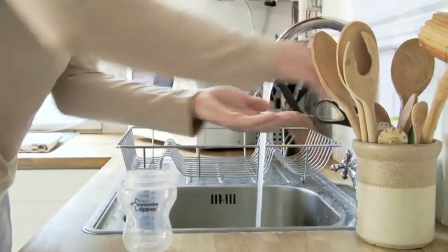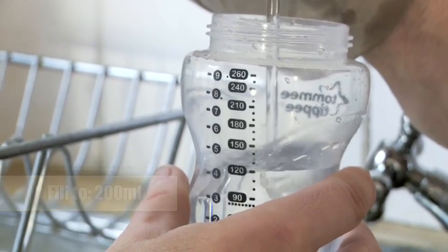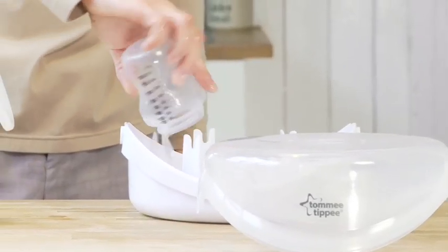Before you use the electric breast pump, remember to separate and sterilise each component that will come into direct contact with the breast or its milk. Use one of our sterilisers in the Closer to Nature range, or try the compact steriliser box that comes standard with the electric breast pump.